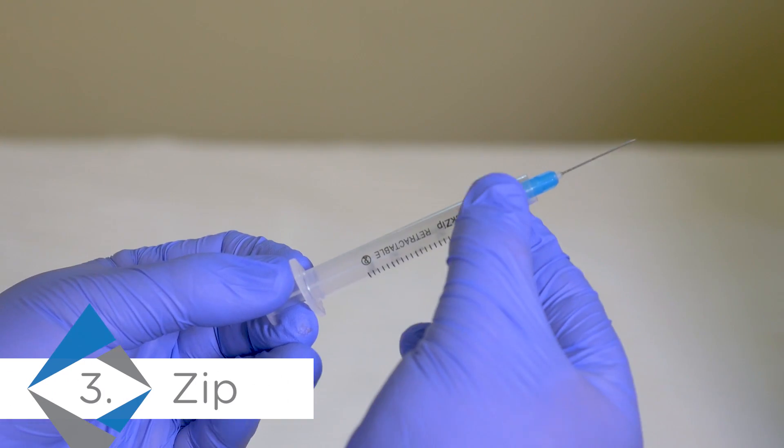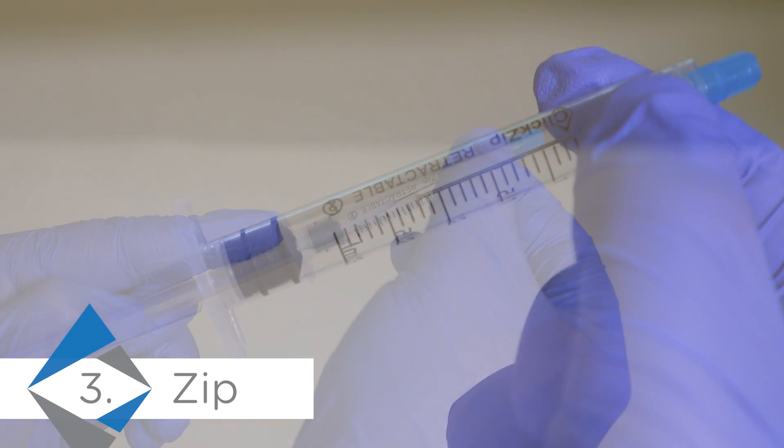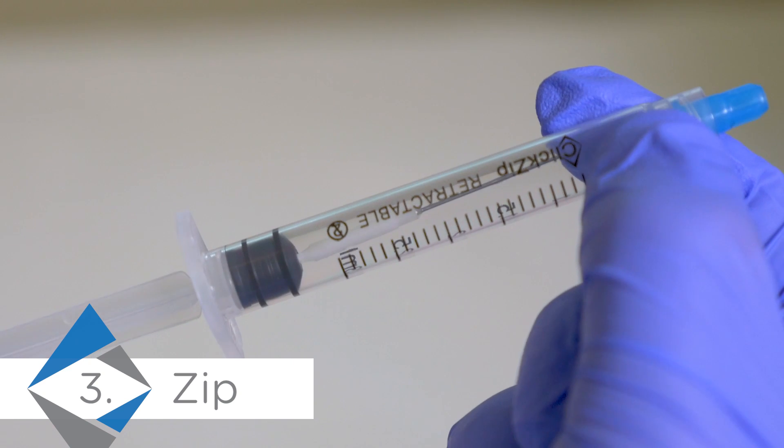Zip the plunger back to retract the needle safely into the barrel. The needle will tilt to one side, encapsulating the needle in the barrel of the syringe.